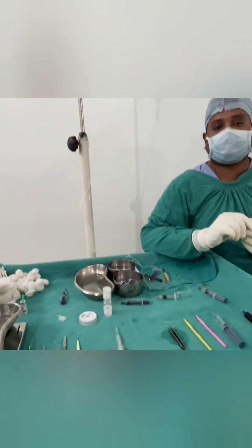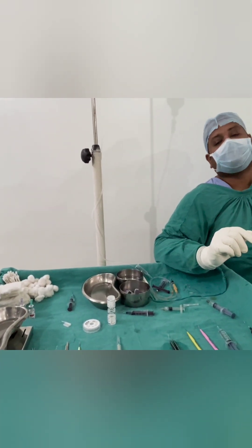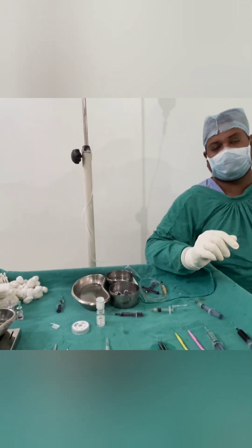So this completes the facoemulsification cataract surgery in case of an immature cataract under topical anesthesia. In such cases, when the nucleus is mature in more than 50% of cases, we try to go for a direct chop technique. If we get a good grip, we proceed with direct chop; otherwise we shift to stop-and-chop or flip-and-chop.